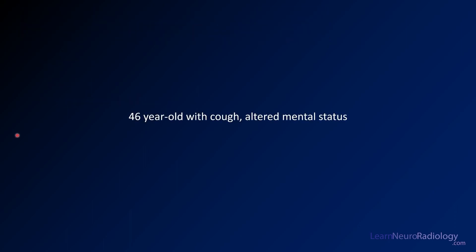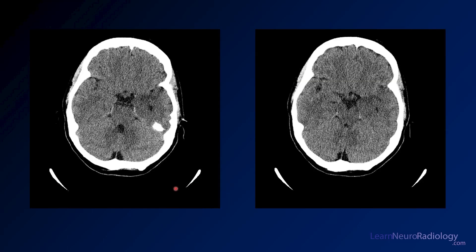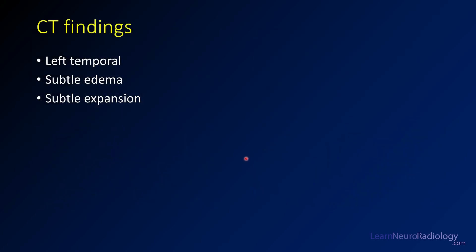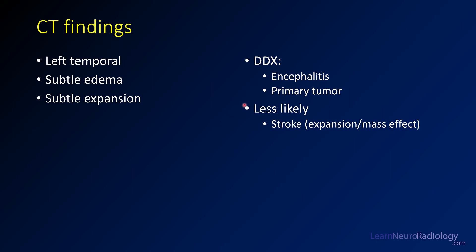Our case here: we have a 46-year-old with cough and altered mental status. Here we have some images from a CT. They don't look that abnormal, but if you look at the left anterior temporal lobe, maybe it's a little bit hypodense, maybe it's a little bit swollen. You might see a little medialization of the uncus there. On the adjacent CT slice, there's a little bit of swelling of the medial left temporal lobe, a little bit of edema, a little bit of subtle expansion. When you see that, your primary differential is going to be encephalitis or a primary tumor.